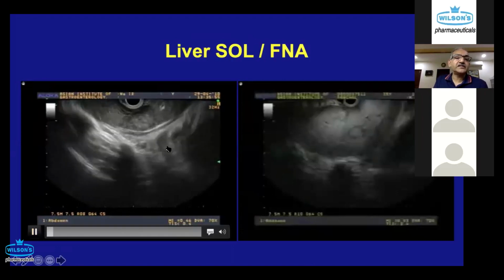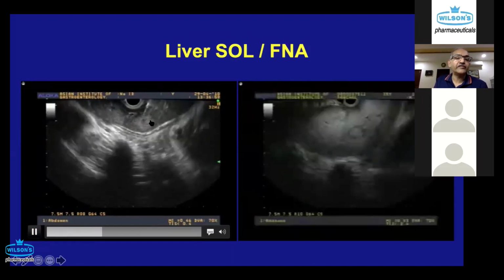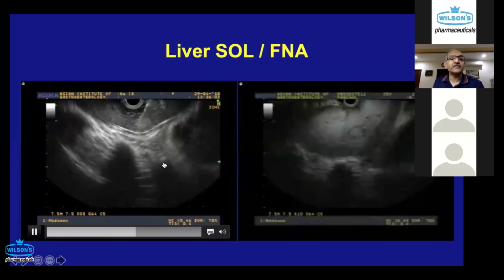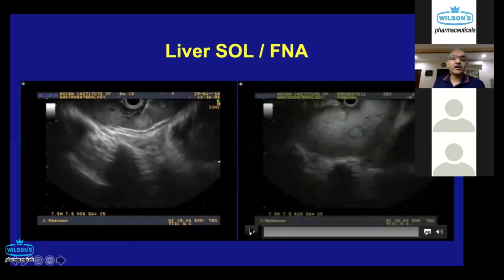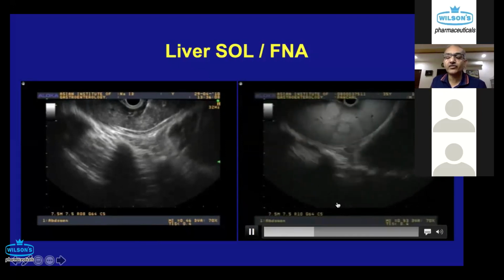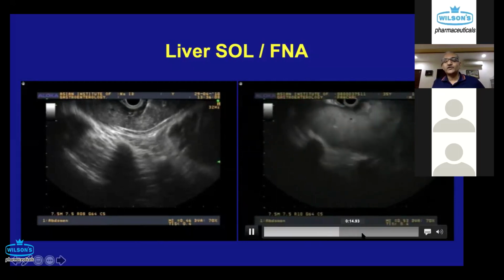We also see the secondaries inside the liver, and if you see such lesions, then you can also FNA them, because this gives the highest stage of the tumor or any malignancy. And if this is positive, you can always say it's a stage 4 disease. For a primary disease which looked resectable on other imaging, EUS showed us these. Another example on the right side, you can see multiple liver metastases, very commonly seen by ultrasonographers who can do an FNA. But this is just to show that we can also do the same.